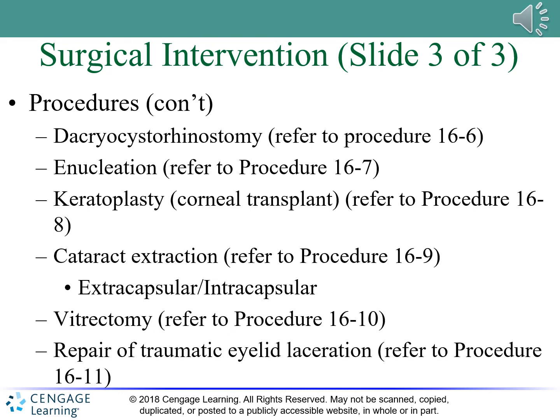Under the equipment, second column, second bullet, there's your intraocular lens implant, or IOL. You'll see this on the board if you're in the eye room. You'll do IOL OD or IOL OS, which is you're going to be doing intraocular lens implants on the left or the right, or OU. And then that last bullet, there's the viscoelastic agents such as Healon or Viscoat.